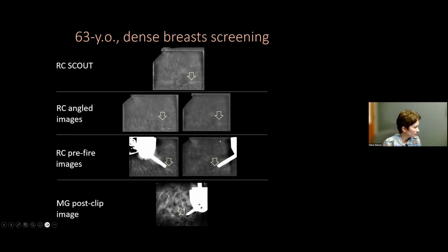So, and this was a CEM. We did a CEM-guided biopsy. You see multiple images of the CEM-guided biopsy, a step-by-step approach. Having a CEM-guided biopsy, if you have a CEM service, is extremely helpful, because if you don't have it, the only way to address the findings which are most pronounced or only seen on recombined images is to do an MRI and MRI-guided biopsy.